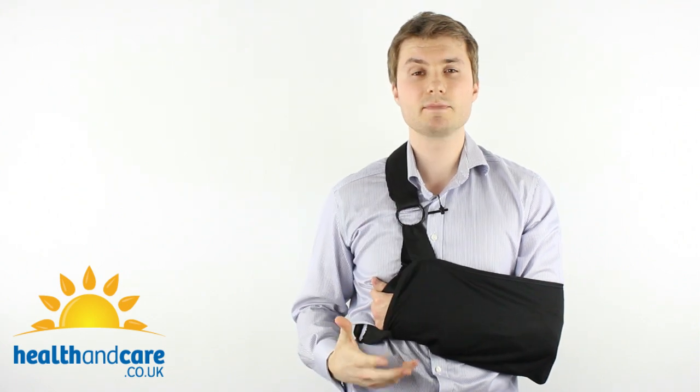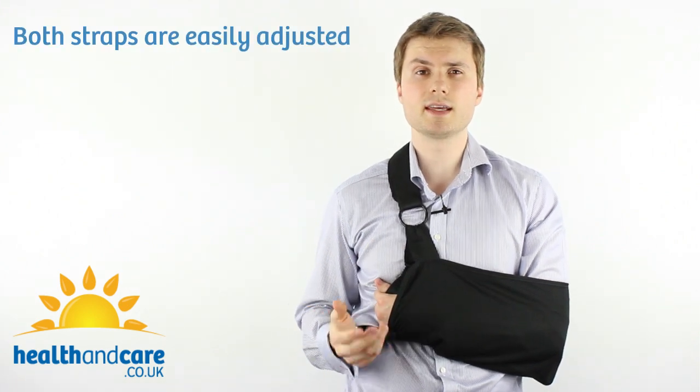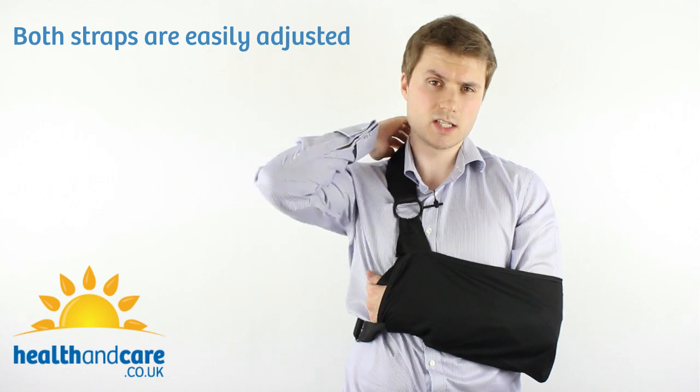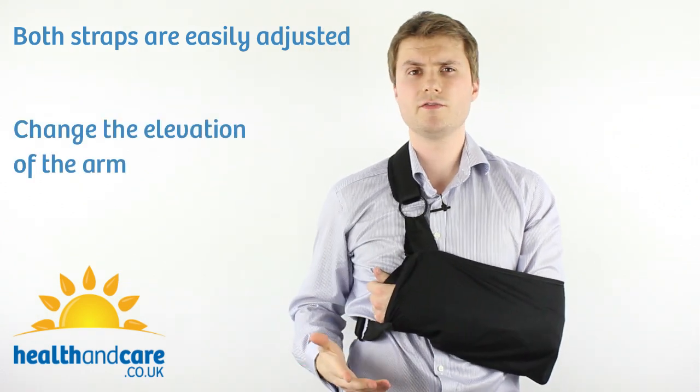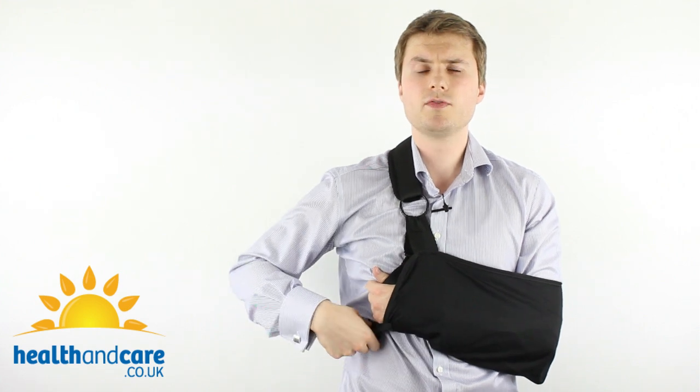You can easily adjust both straps. They've got velcro, so you just undo it and you can change the elevation of the arm at the drop of a hat — very straightforward. The same is true of the waist immobilisation strap.